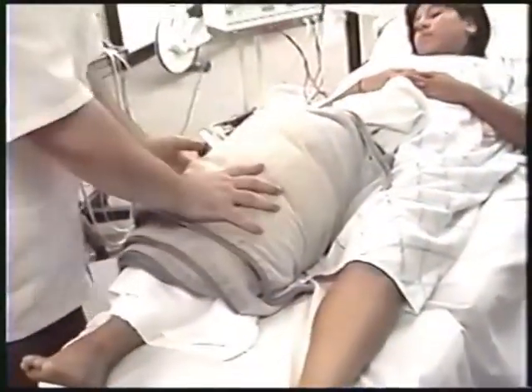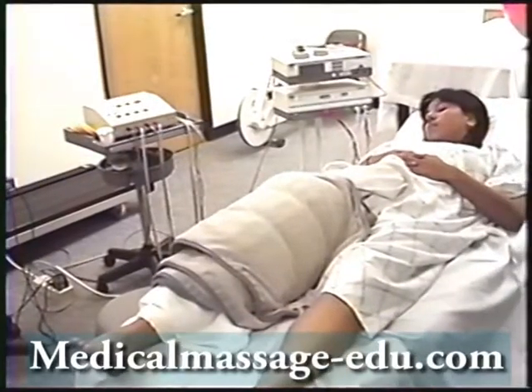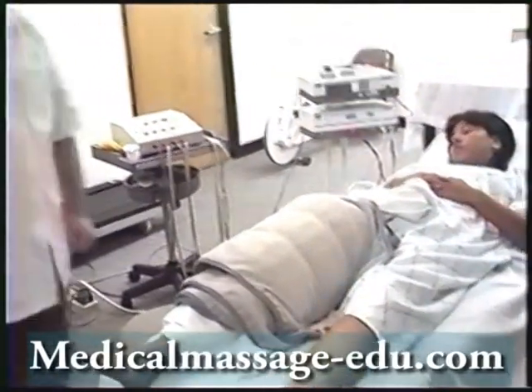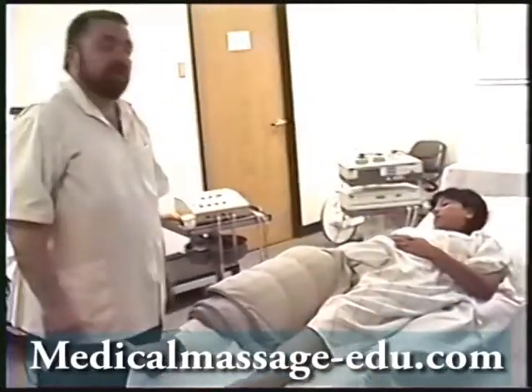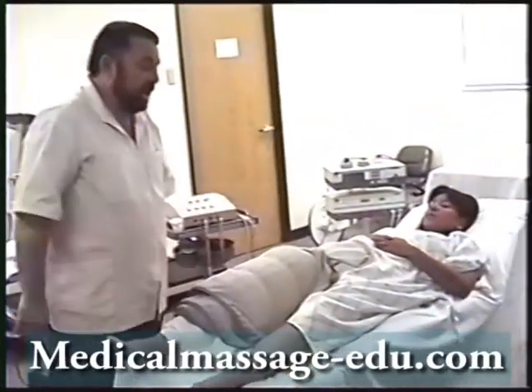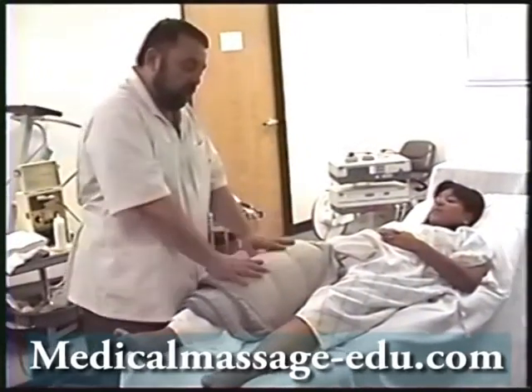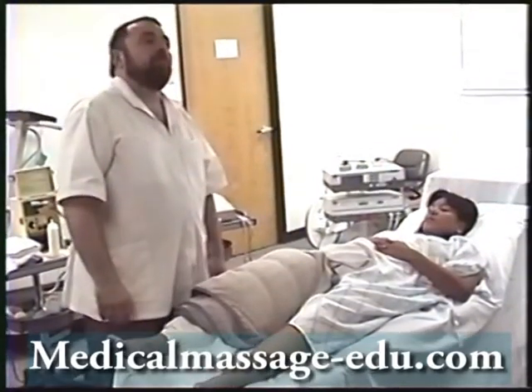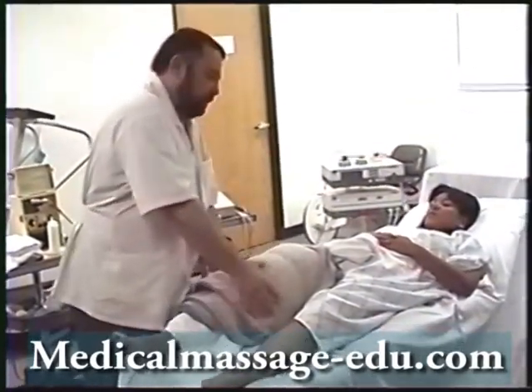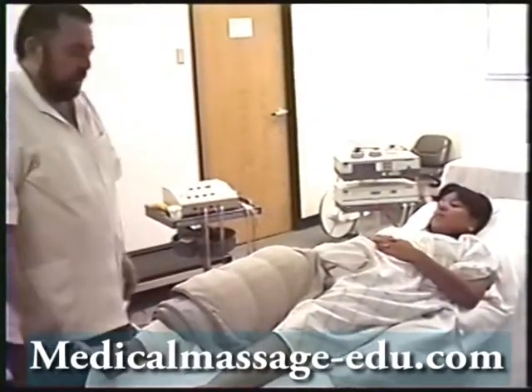The average is fifteen minutes. Very important — although this is an unattended treatment, it is important during these fifteen minutes to check in and ask the patient how they feel, whether it is too hot. If it is too hot, we add an additional towel. We can use a smaller hot pack as well — there are different sizes. The big one is good for surrounding the entire injured area.